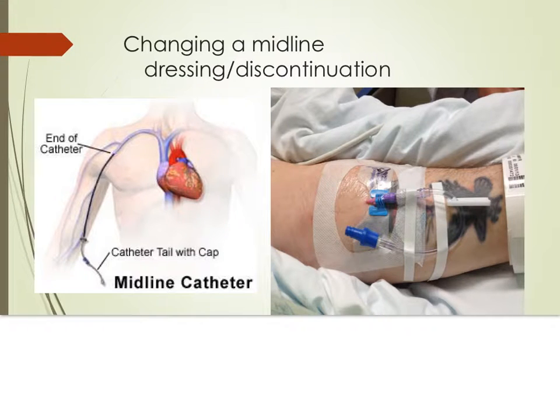As you will recall from Unit 3, a midline catheter is a long peripheral IV that is placed in a peripheral vein, generally inserted near the antecubital fossa, and the tip ending below the axilla. These catheters are generally between 3 and 8 inches long and are used when therapy is anticipated to last from 1 to 4 weeks. Stabilization devices used for midline can vary. Use the techniques we previously discussed for PICC line dressing in order to change a midline dressing. There is a sample policy and procedure listed in the handouts for this unit that you can also refer to.